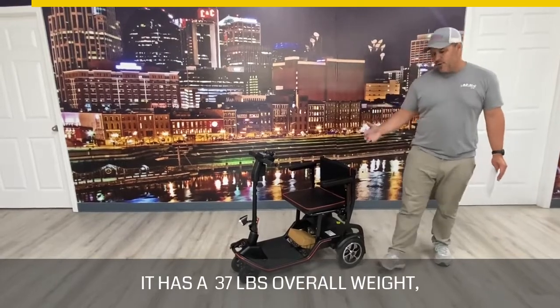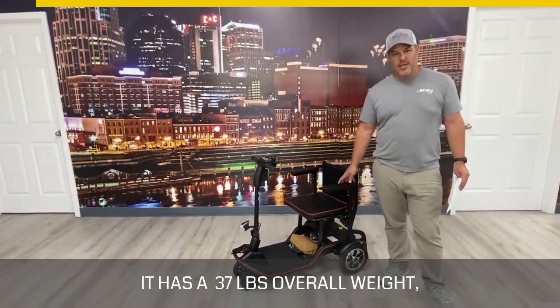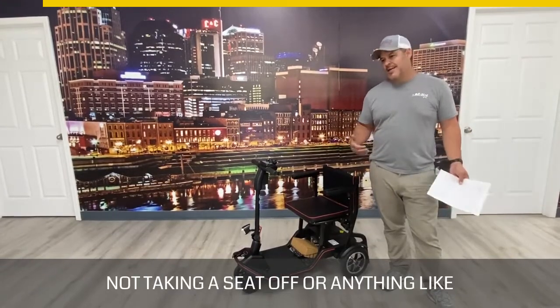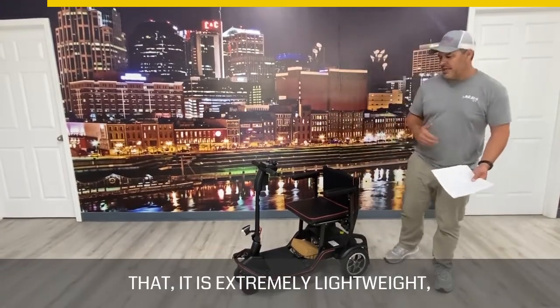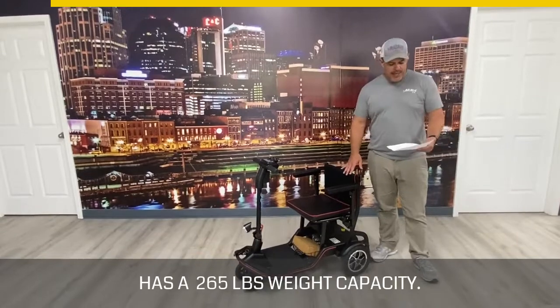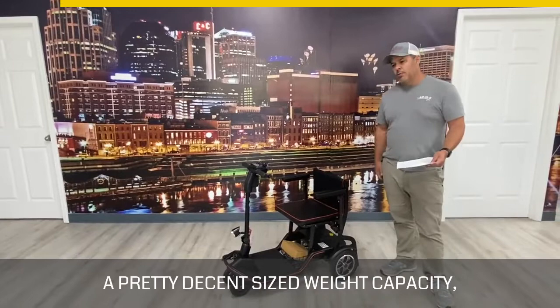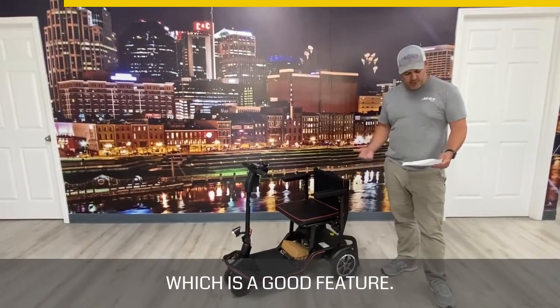It has a 37 pound overall weight — and when you really think about it, that's the entire scooter, not taking a seat off or anything like that. It is extremely lightweight and has a 265 pound weight capacity, which is a pretty decent size weight capacity and a good feature.